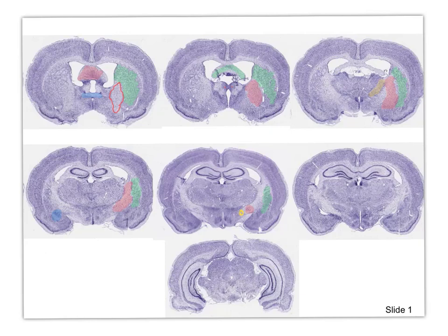Let me get rid of it so you can see it. I'm going to outline it for you, if my drawing's good enough. Much smaller in a mouse, and so it's more difficult. So once again, posterior limb of the internal capsule, and here is still our posterior caudate, and now we're well into the amygdala in this area.